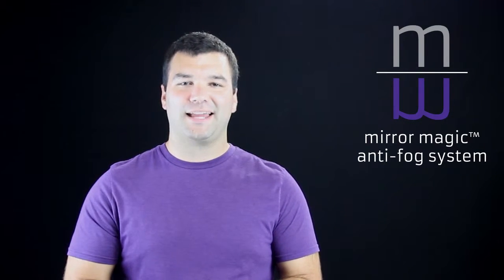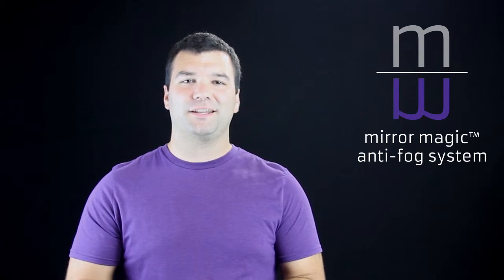Dental professionals battle a foggy mouth mirror every day. They're fighting moisture and debris while trying to examine, clean, and restore teeth.